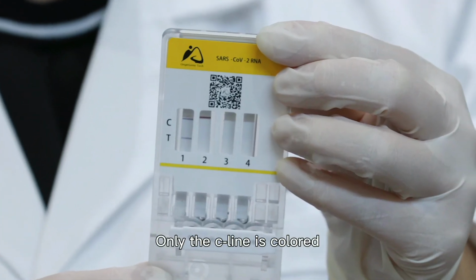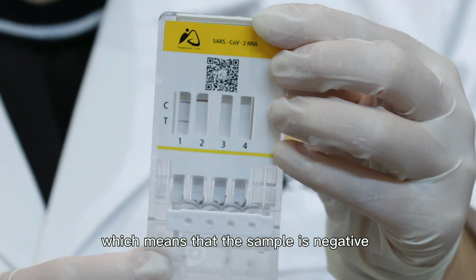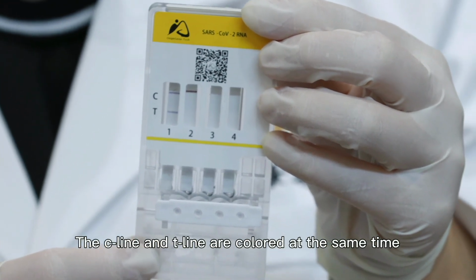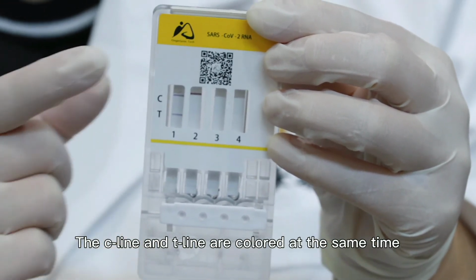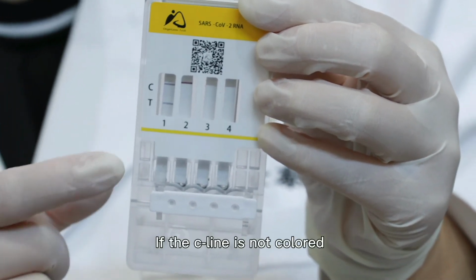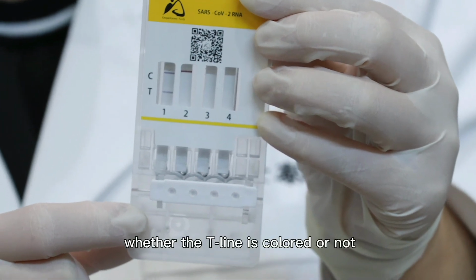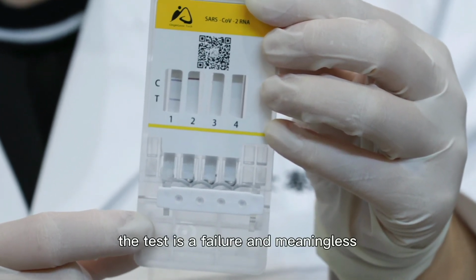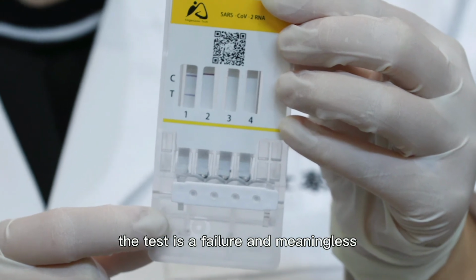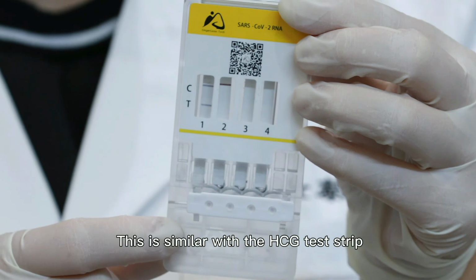Only the C line is colored, which means that the sample is negative. The C line and the T line are colored at the same time, which means that the sample is positive. If the C line is not colored, whether the T line is colored or not, the test is a failure and meaningless. This is similar to the HCG test strip.